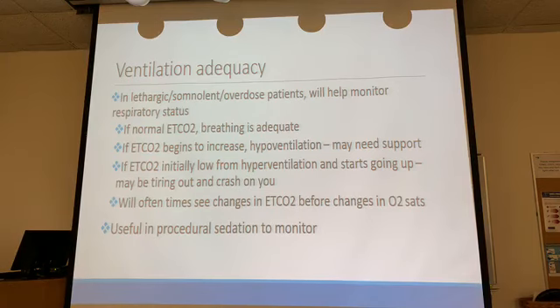because that's really going to confuse you and mess you up to the point where you're not going to be able to tell, wait a minute, do I need to bag more? Do I need to bag less? Do I need to get bicarb? What do I need to do with this patient? So try not to get into the jungle of trying to figure out, oh, this patient's got to be acidotic because the end-tidal CO2 is this, and I need to give them bicarb, because it's going to completely mess you up. That's not what end-tidal CO2 tells you. It doesn't give you the pH. It tells you what's going on with the ventilation, and it tells you what's going on with the perfusion. So keep that in mind.